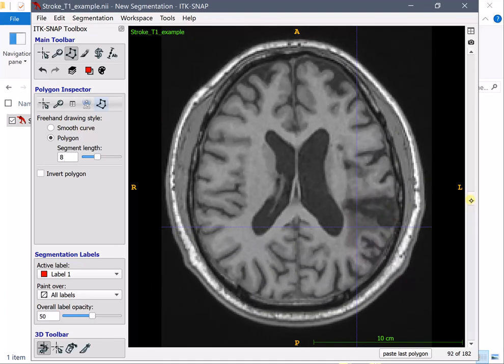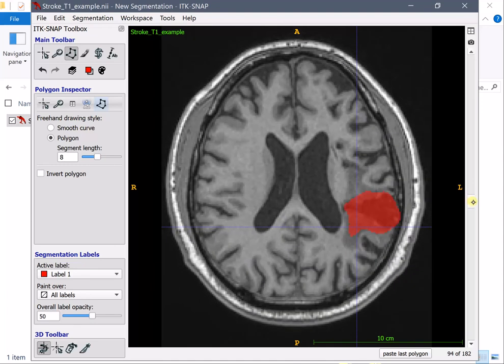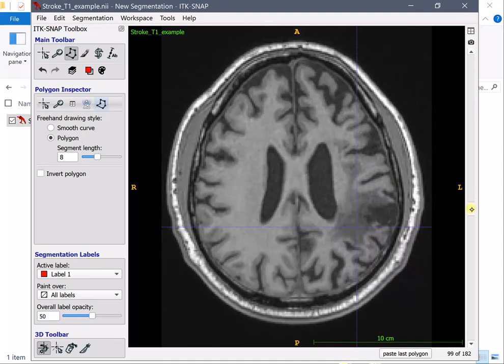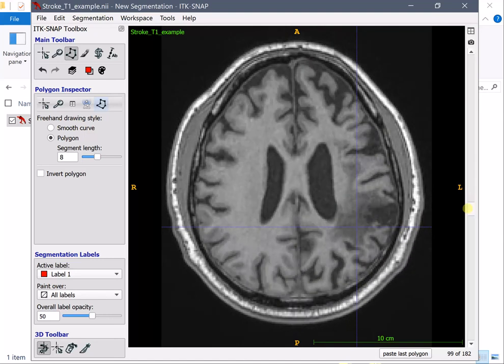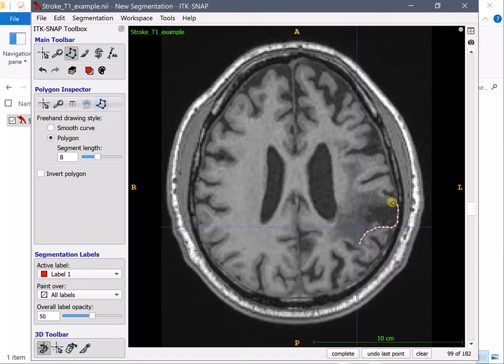So now we see that we have a bunch of slices up here that needs to be drawn and that's what I'm going to do.